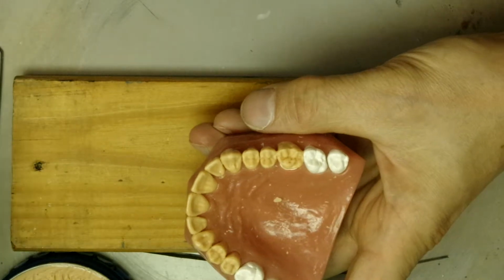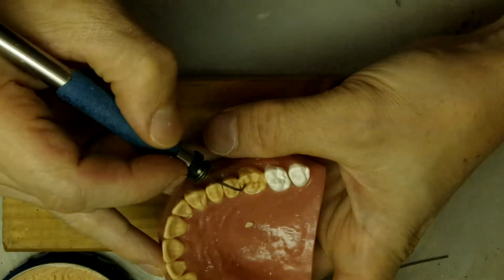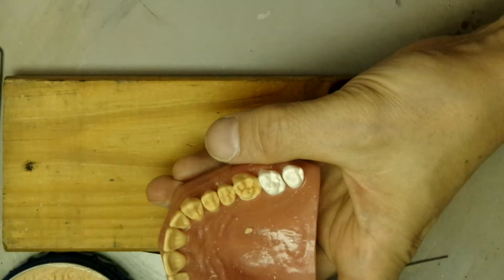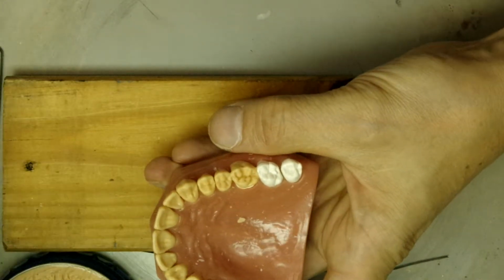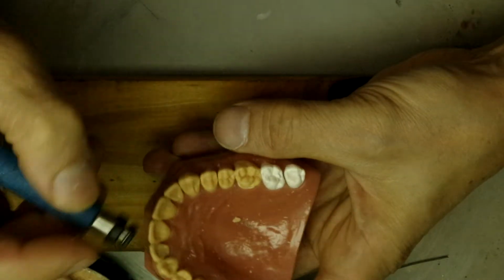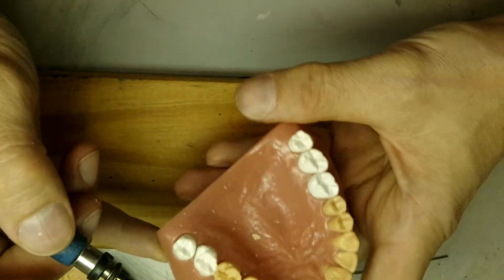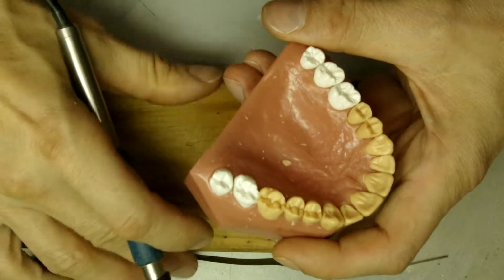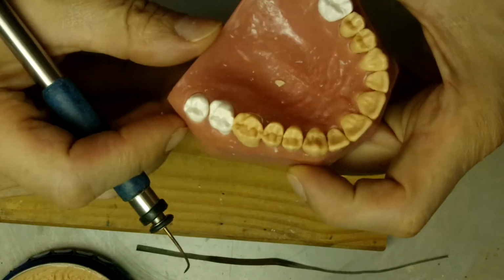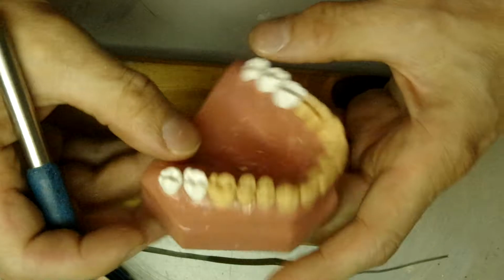It's all about the heat, everybody. All about the heat. So try to get that heat under control. Takes a little bit of time, but you'll get it. Okay. So that's some of our occlusal anatomy. It's not finished yet, but we got a good start.